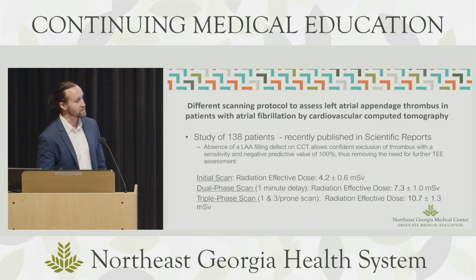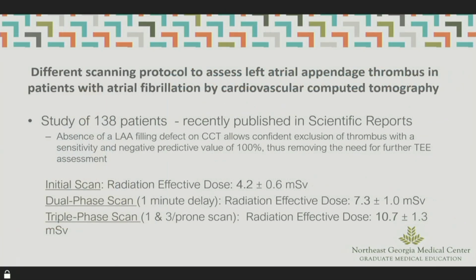The issue with this, though, is that if you look at your initial scan at 0 minutes, your radiation dose is only 4.2 millisieverts. If you add that extra 1 minute delay, your total effective radiation dose is 7.3. Now, if we just routinely start doing triple phase scanning on every single patient, your effective radiation dose increases to 10.7 millisieverts.